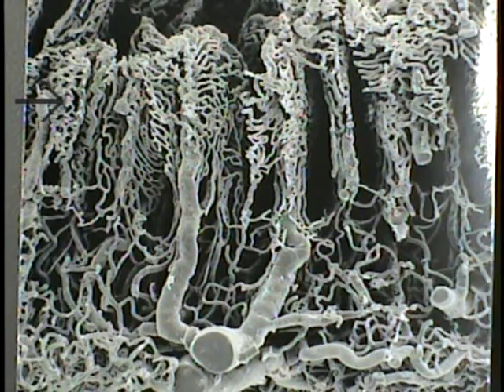This particular figure is a scanning electron micrograph of a cast made through the vasculature within intestinal villi. It is courtesy of Jay Browning of Flinders University, South Australia. What it shows is the vessels coming up into the villi, which are at this location as indicated by the pointer. Another one is shown here. And what it demonstrates is that elaborate capillary network just underlying the intestinal epithelium covering the villi.